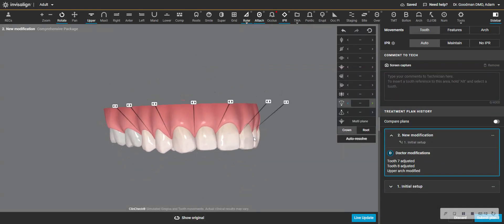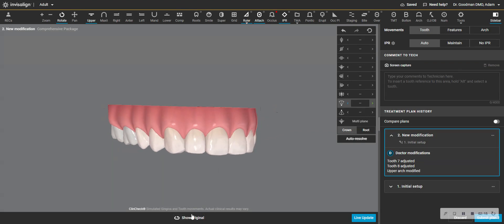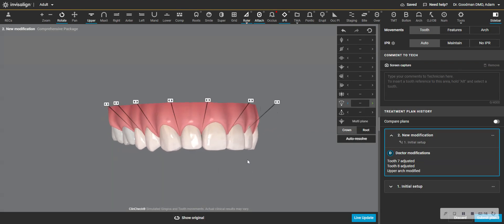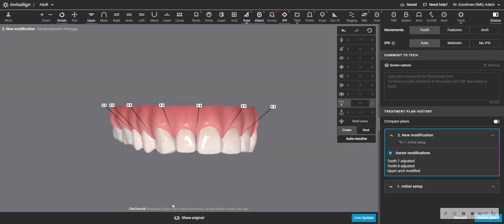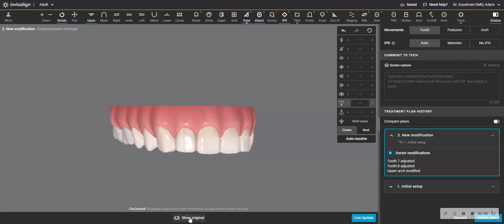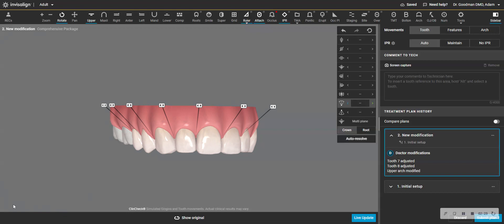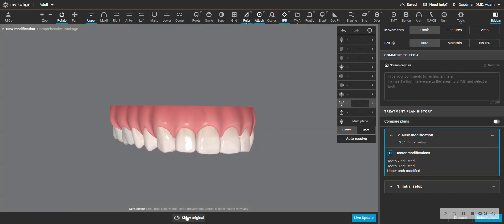And by the way, as I'm showing you this, do you see there's just the tiniest bit of root angulation? Maybe that was made worse by what I did. Remember, you can't see this unless you go stage one to stage 20 or however it is, or you're in this tool.